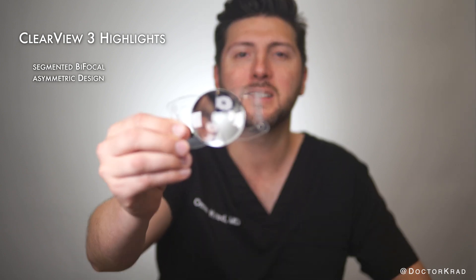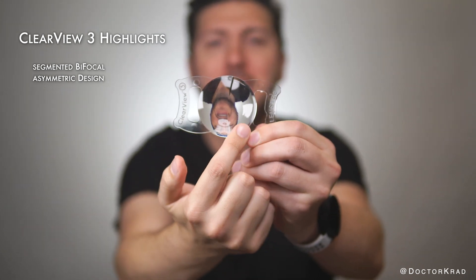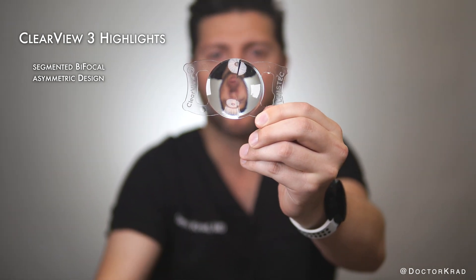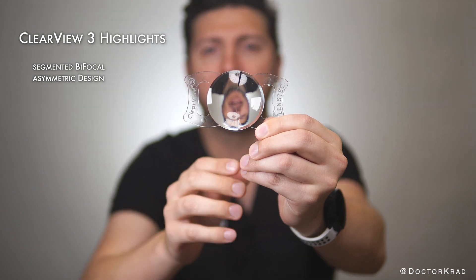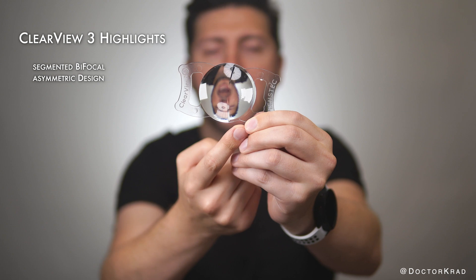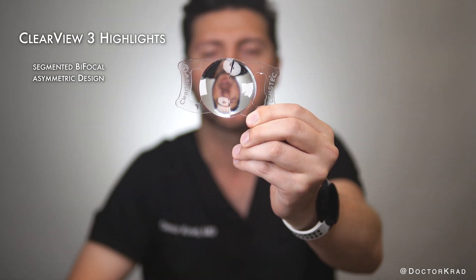It has an asymmetrical lens design with a distance portion and a near portion. The distance portion is slightly bigger than the near portion. About half the lens optic is dedicated for far vision, there's a transition zone, and then there's the remaining 42% of the lens which is dedicated to near vision.